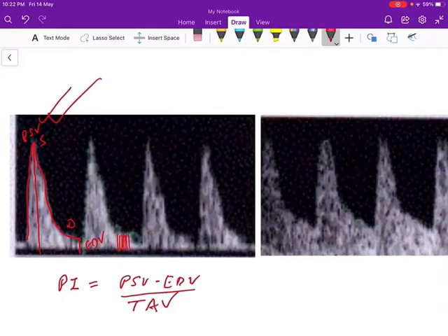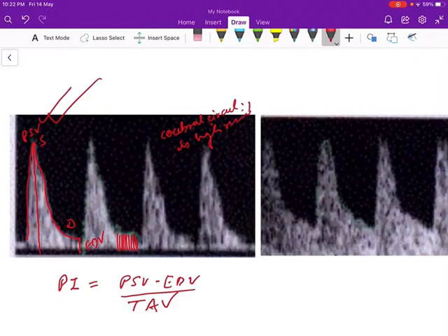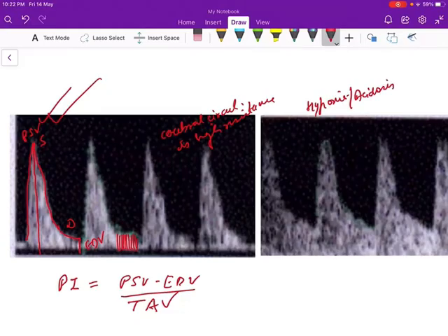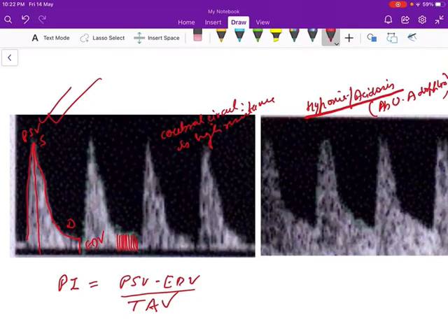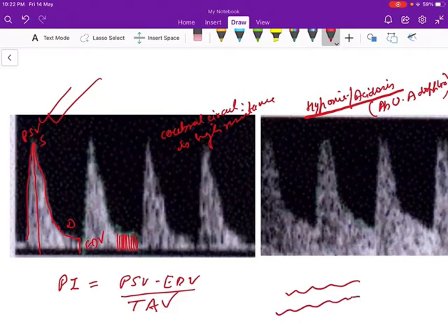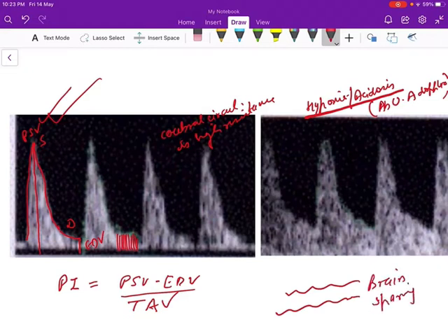This diastolic flow is not that high because the cerebral circulation is high resistance. But when the fetus develops hypoxia or acidosis — why hypoxia or acidosis? Because of the increased placental resistance depicted as abnormal umbilical artery Doppler. When the fetus develops hypoxia or acidosis, cerebral arteries tend to become dilated in order to preserve blood flow to the brain. That's called the brain sparing effect.